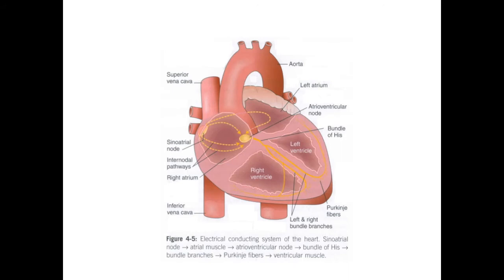When we're thinking about ECG, the big thing I want you to have in your mind is that it's about electricity and how we capture the electrical activity in the heart. Before we go through the specifics of what an ECG looks like and how we interpret it, I want us to think about how it's generated.